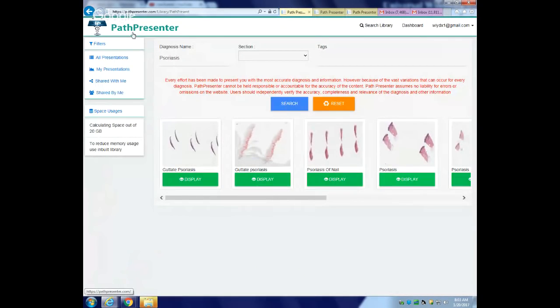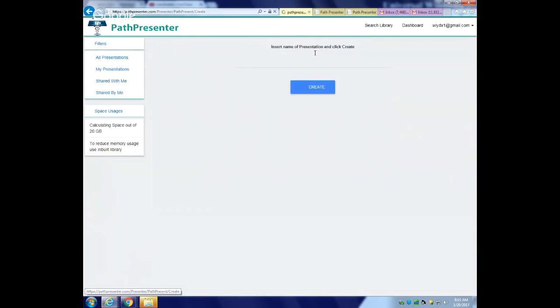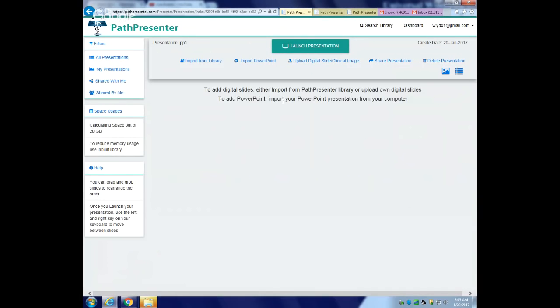Now, if you want to use this for making a presentation, you click on new presentation, and then you give it a name, whatever name you like, PP Path Presenter 1, and then you create. Once you've done this, you can either make a presentation that is only digital slides, or you can make a presentation that has both digital slides and a PowerPoint.